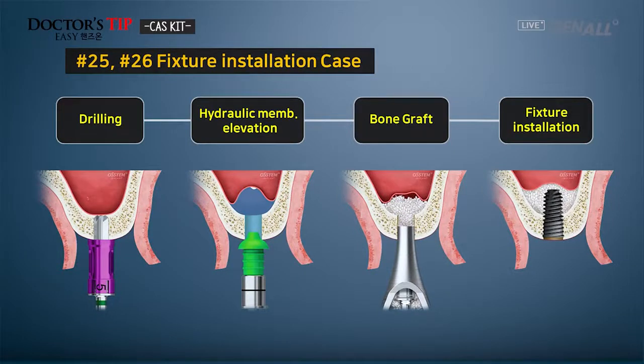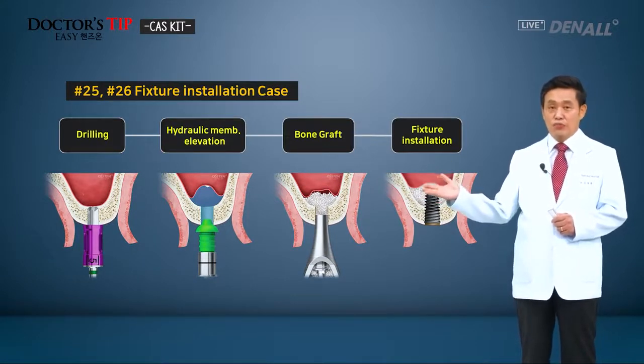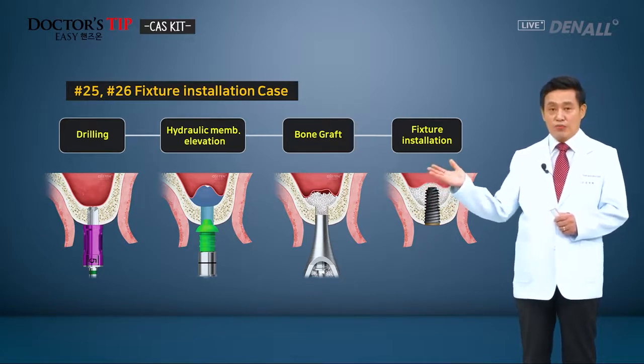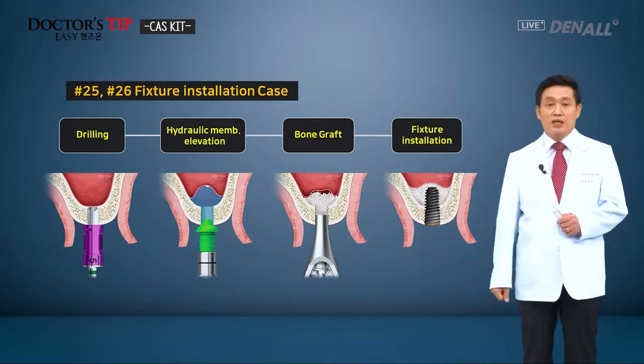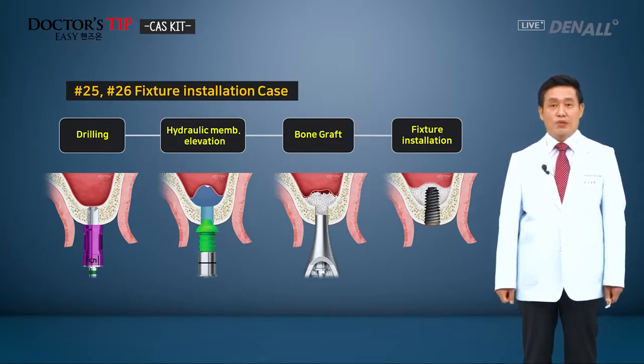In this model, numbers 25 and 26, two teeth, are missing. As I explained, CAS KIT drills will be used to penetrate into the sinus floor. After that, the hydraulic elevation tool will be used to safely lift the sinus membrane. After that, the bone carrier and condenser will be used for the bone grafting, and the fixture will be installed. Through this hands-on, you will be able to see this process. I'll come back to the hands-on. Thank you.